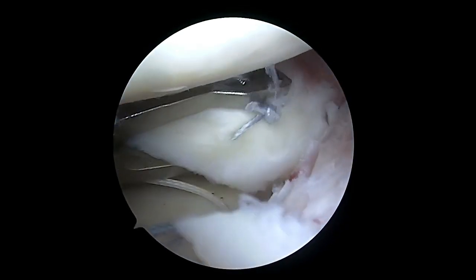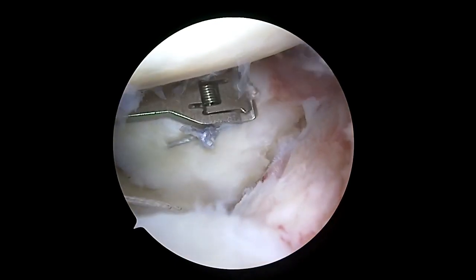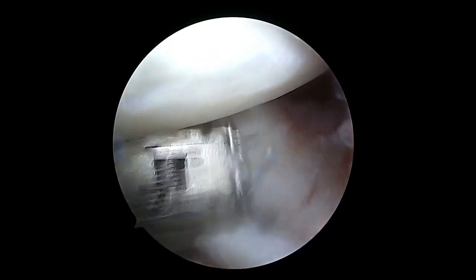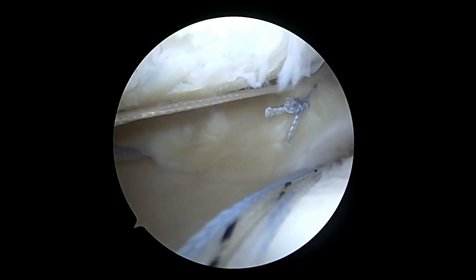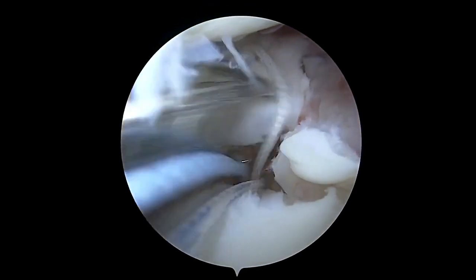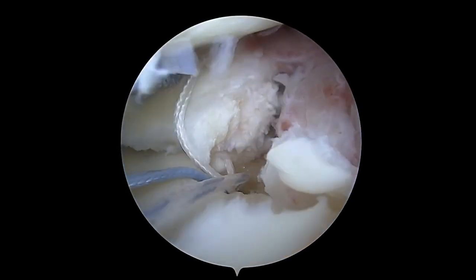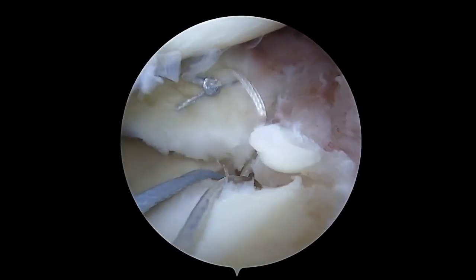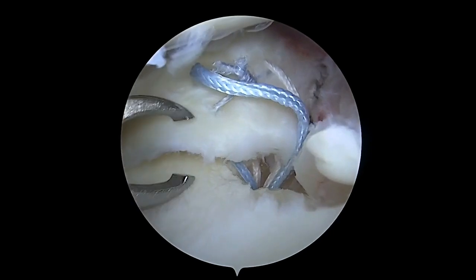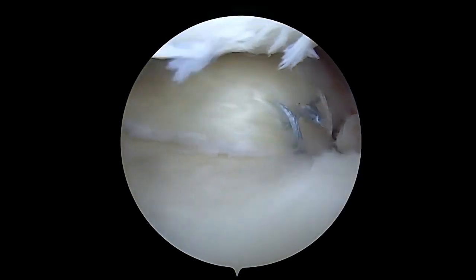The root repair sutures are then placed on the opposite side of a previously placed intra-meniscal vertical mattress, which functions as a ripstop. We do this using a self-retrieving suture passer such as the Arthrex knee scorpion. The repair suture is fed through the knotless mechanism via the link sutures and positioned appropriately to maximize the ripstop. This is repeated with the other repair suture, and the repair is then tensioned maximally. The reduction of the root can be seen here.